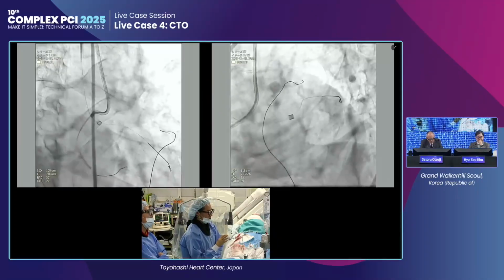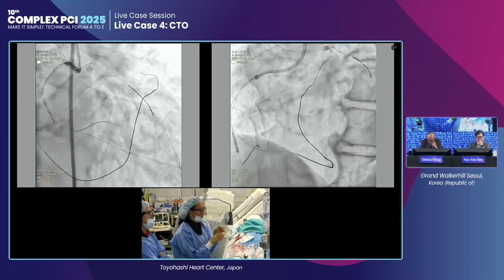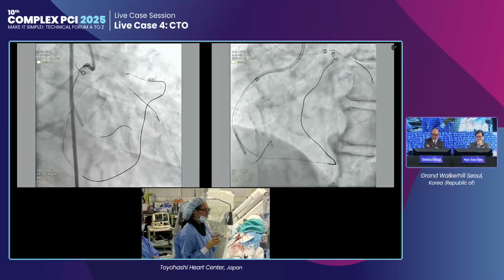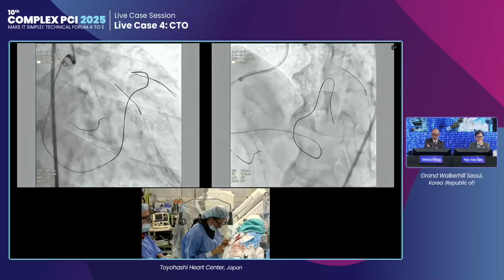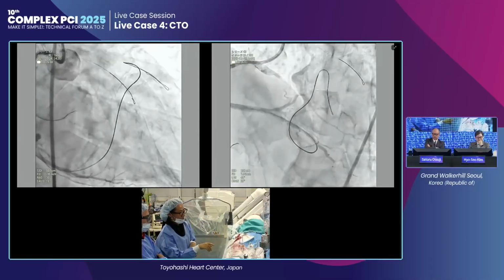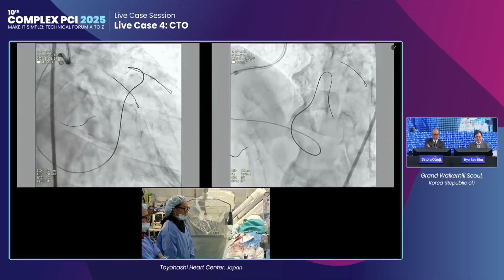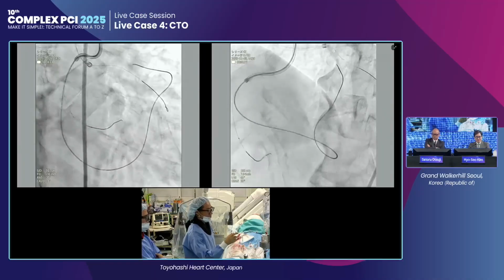Next. However, you can see at the proximal site, the bending portion cannot advance. So I selected Corsair XS. And the guide wire fortunately negotiated to the D3 diagonal branch, so we can advance the microcatheter to the diagonal branch and coming back.